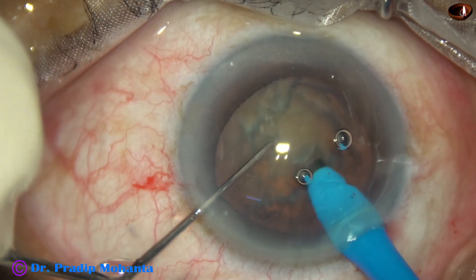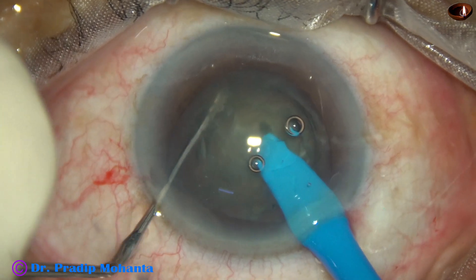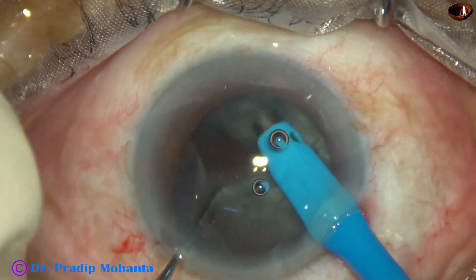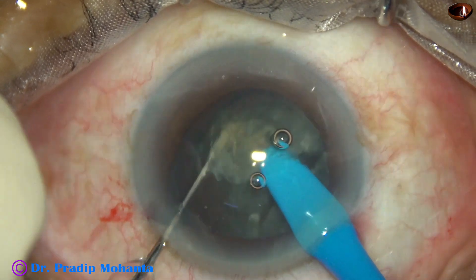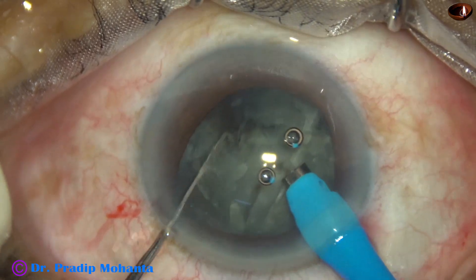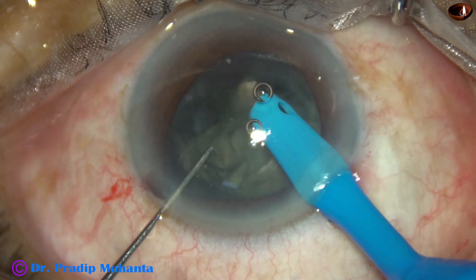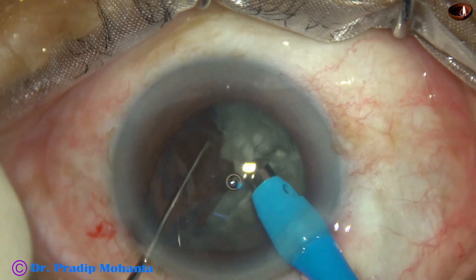And now direct chop. One or two sculpts, then go into the substance of the nucleus, hold it firmly and chop. Rotate, separate the two hemi-nuclei, then one hemi-nucleus is held again and it is chopped. I always bury the tip into the substance of the nucleus so that occlusion is good and I get a strong hold of the lens matter.